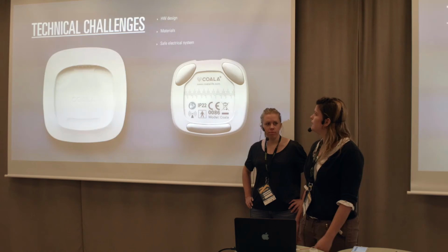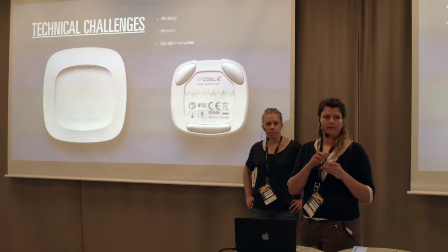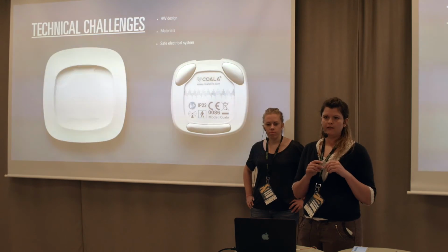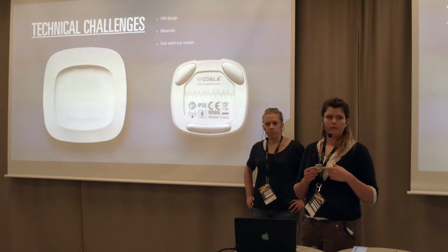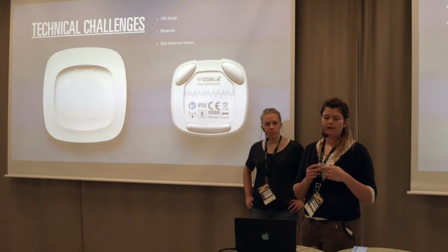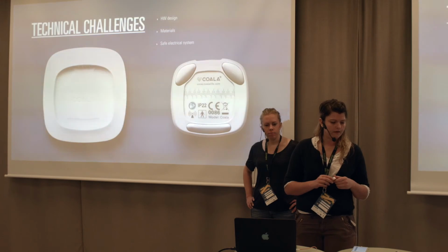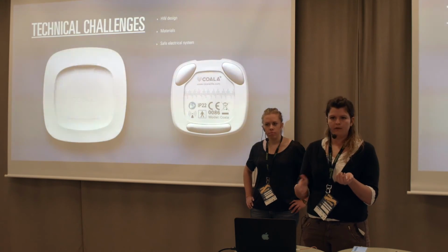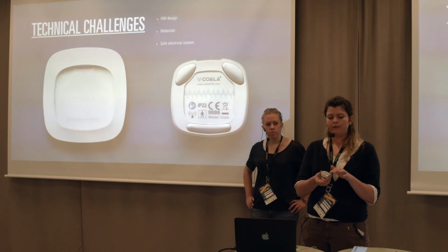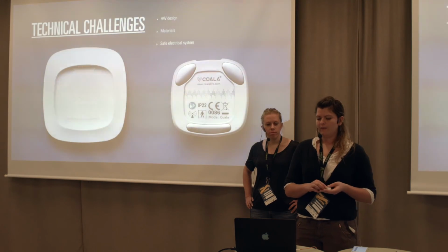And the hardware also had some issues. Since it's a medical device, it needs to be biocompatible. So the plastic shouldn't give any allergic reactions. The electrical system needs to be super safe, and it should be safe to use. I don't have the docking station here, but when you charge it, you put it in the dock, and then you're not able to do a measurement. You can't reach the electrodes. You won't get electrified if you do, but it's still a safety thing.